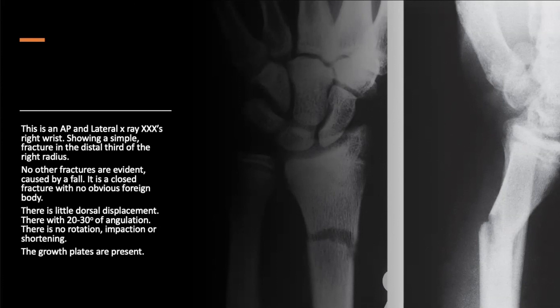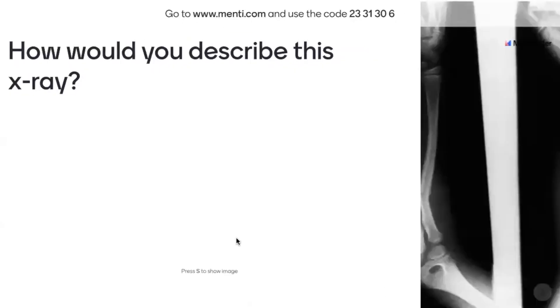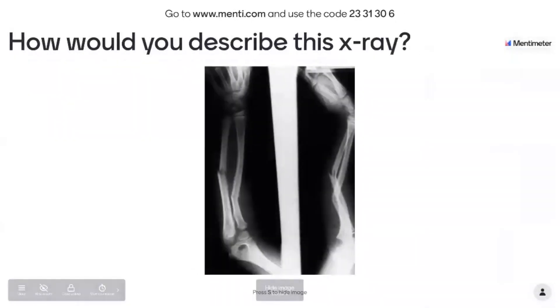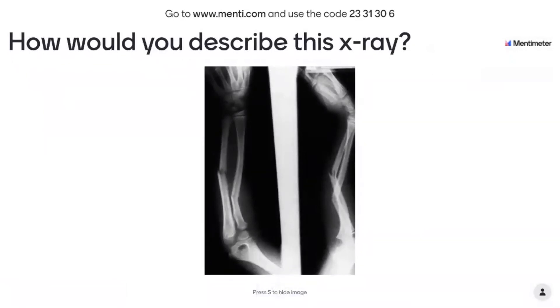I'm going to have another case now. This is a classic banana arm, probably from falling off monkey bars. Have a look at this and think about some of the language — you can make the name up for the patient. What do you think about this x-ray?